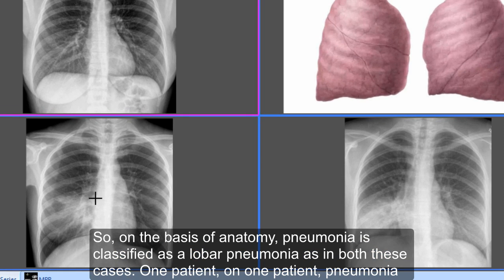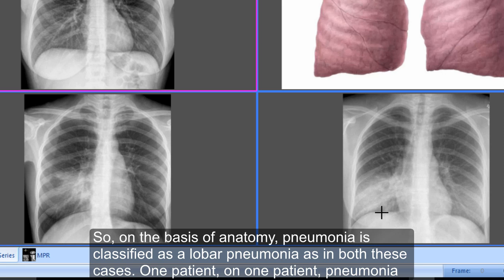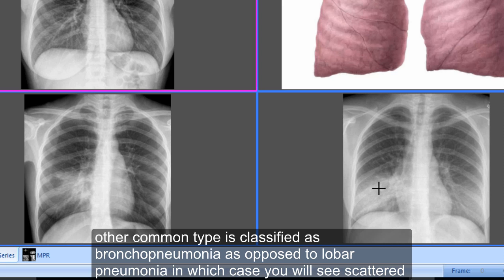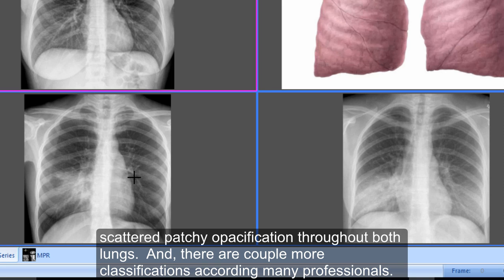On the basis of anatomy, pneumonia is classified as lobar pneumonia, as in both these cases — one patient has pneumonia in the right middle lobe and the other in the right lower lobe. Pneumonia can be present in any lobe. The other common type is bronchopneumonia, as opposed to lobar pneumonia, in which you will see scattered patchy opacification throughout both lungs. Both cases here are lobar pneumonia.